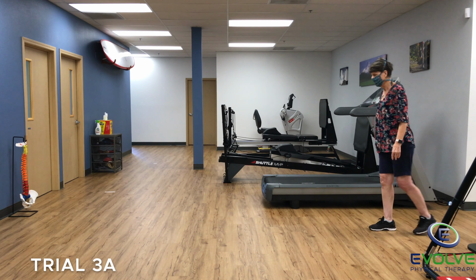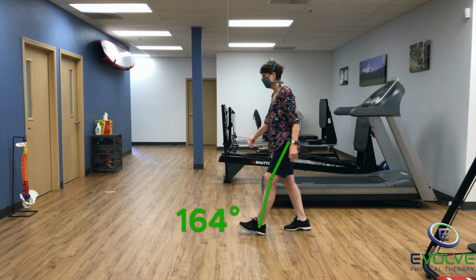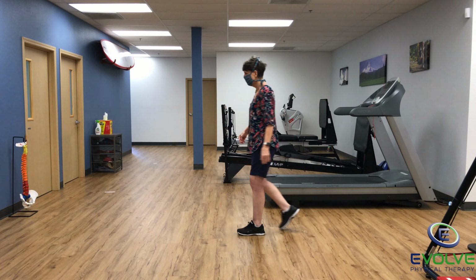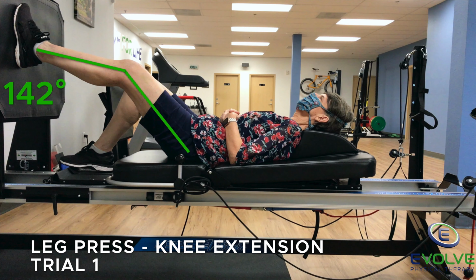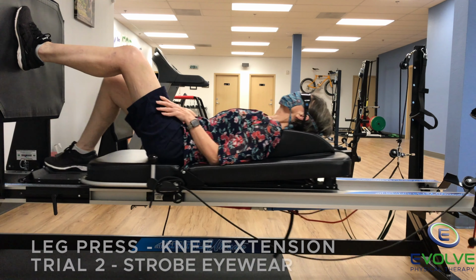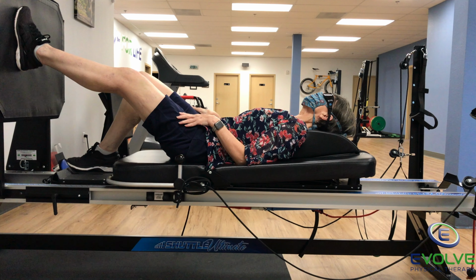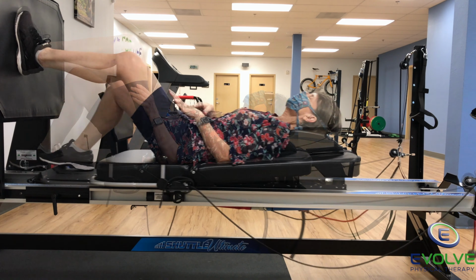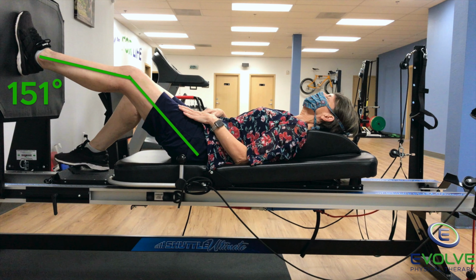For the third trial, her knee flexion has improved by 5 degrees compared to the first trial and remained the same with initial contact. Next, with leg press, her strength and proprioceptive deficits are visible. When the Strobe Eyewear is used, she has an increase of 14 degrees for knee extension, and with the third trial, there is a 9-degree improvement compared to the first trial.